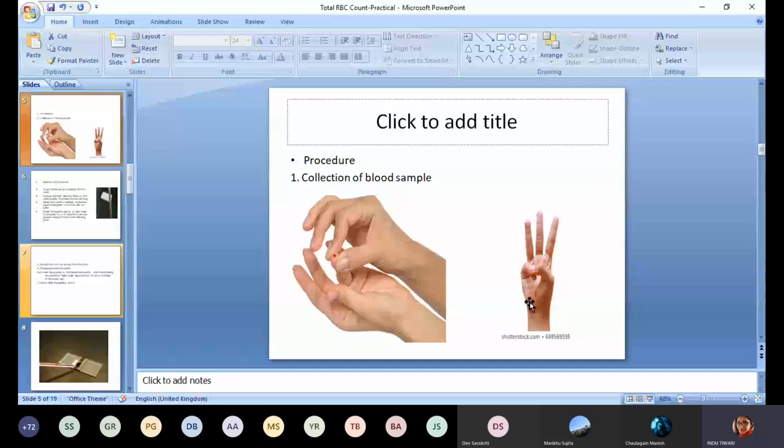The 3 fingers as shown here should be used for the pricking. The thumb and the little finger should not be used because of their connection with the palmar arch of the hand, because any deep pricking that results in a deep wound might cause unwanted or severe infections throughout the hand.